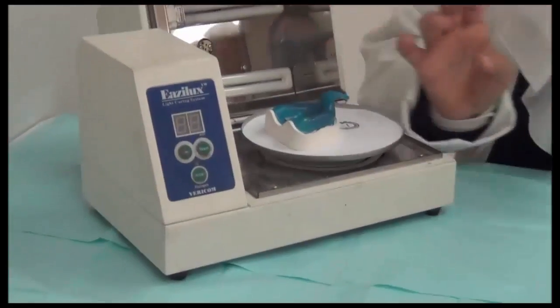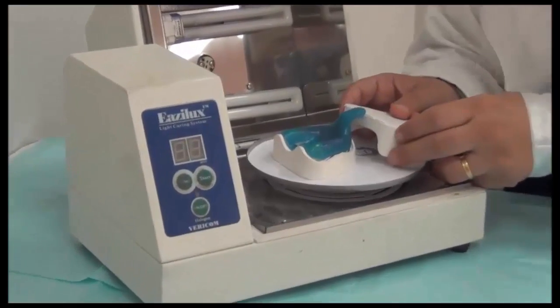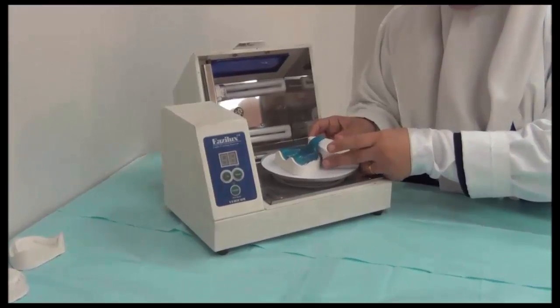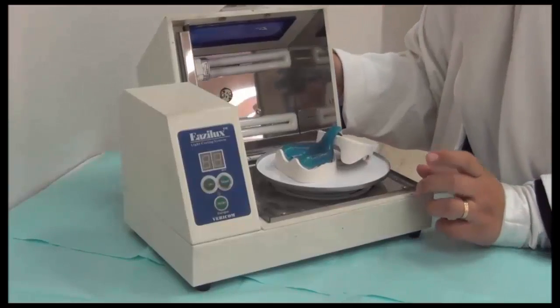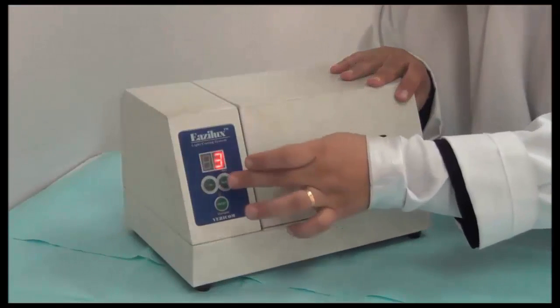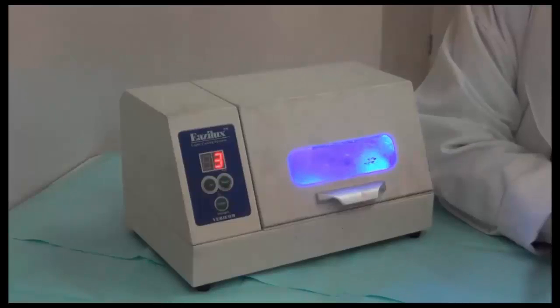We place it inside the light cure. We might get another cast or a cup or any other hard object that could support the handle while light curing the first light cure. Okay. We stabilize it, make sure it's stable, and then we begin our light cure. The time is set. The light cure machine rotates while it's light curing.